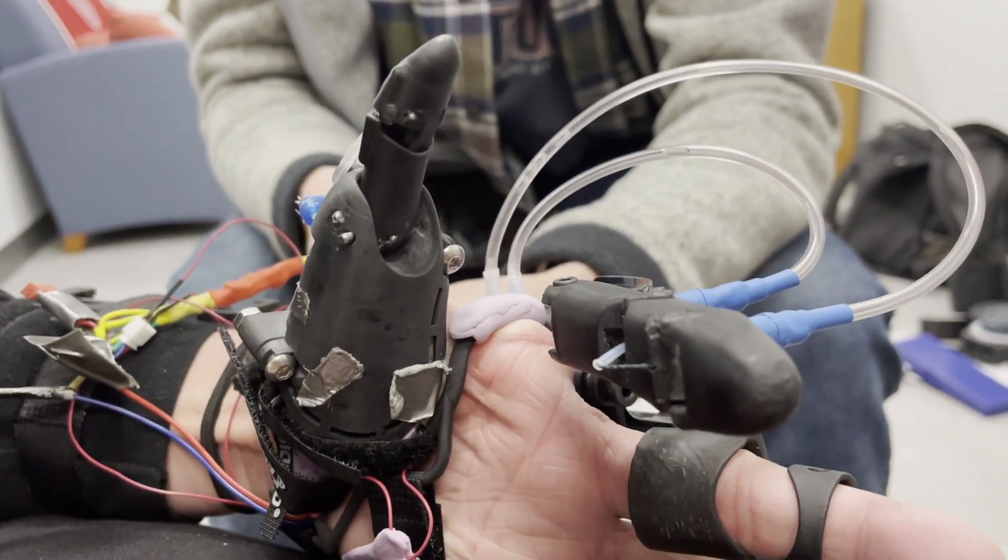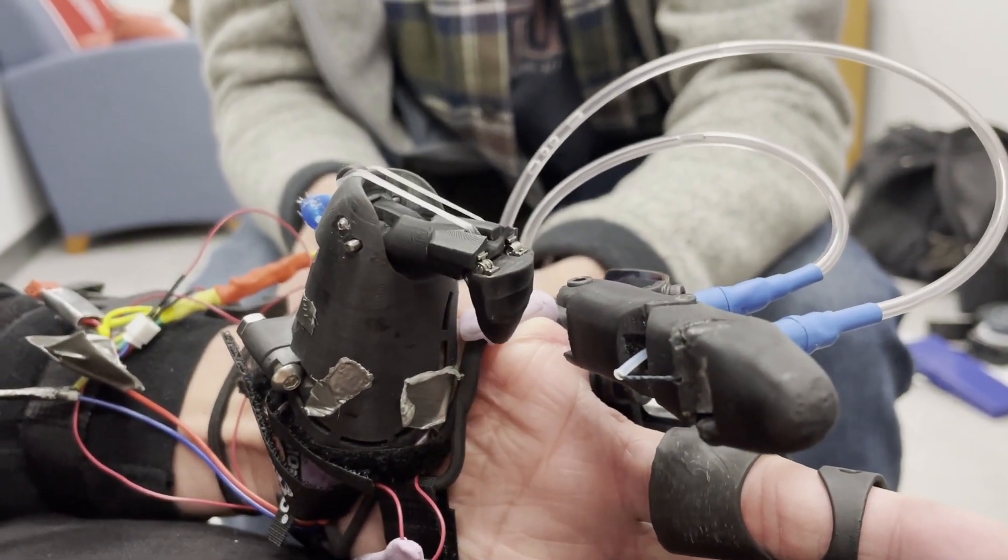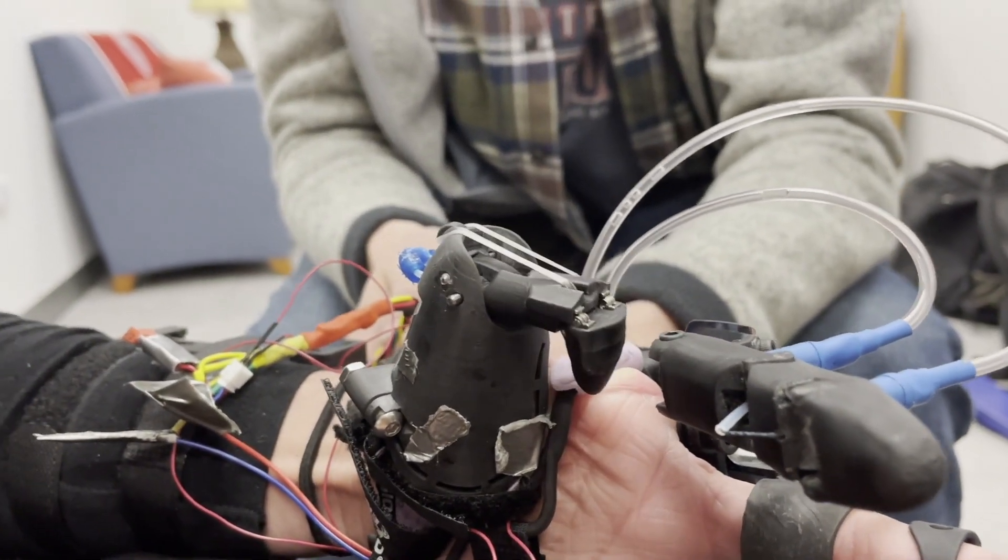The demonstration of this technology will hopefully spark greater communication between prosthetists and surgeons, who typically attempt to make a clean amputation by removing bone fragments like these.